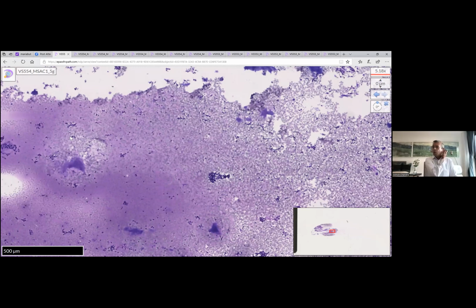It depends very much on what stains and preparations you're used to, but I think Maria would probably agree, and I'm sure many of the other participants as well, that Giemsa stain is really a huge help in the context of a one-stop setting, particularly for thyroid and head and neck and salivary gland lesions, because it shows up the colloid and it shows up the matrix of salivary gland tumors.